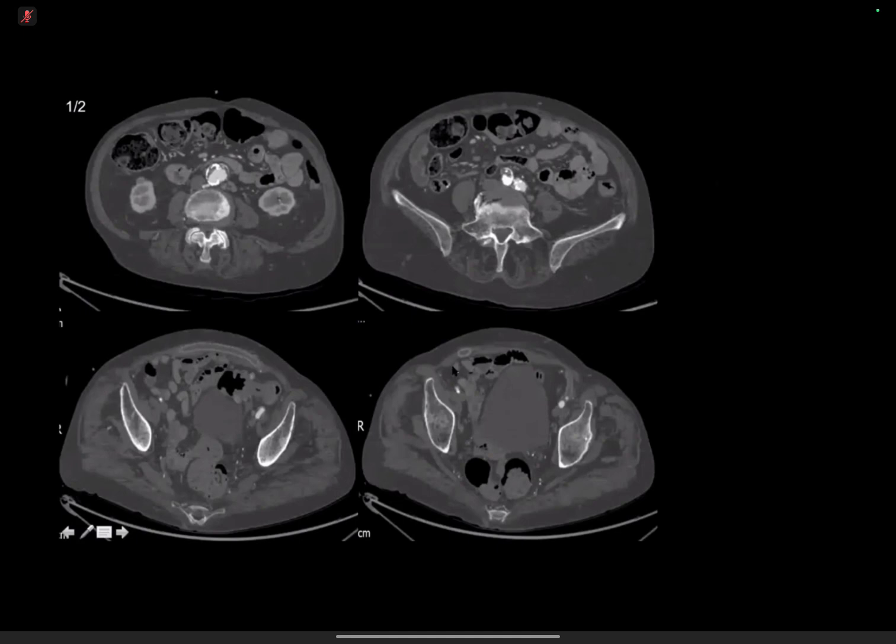So depending on how fresh, this type of graft should be under surveillance. If it's fresh, we can perform thrombectomy plus or minus thrombolysis. If it's not, we can perform angioplasty and maybe restenting. But given the very long segment, I'd also, of course, involve these surgeons in the discussion because he might get revision for the surgery. Okay. Might be the best option.